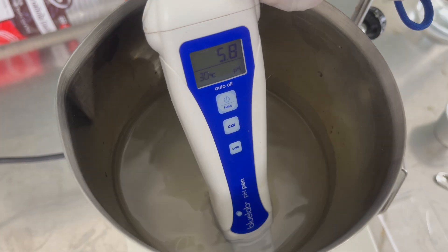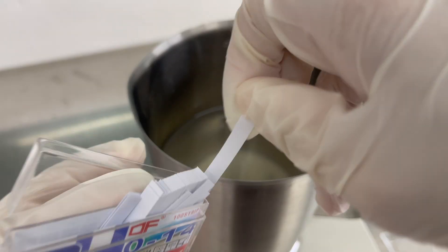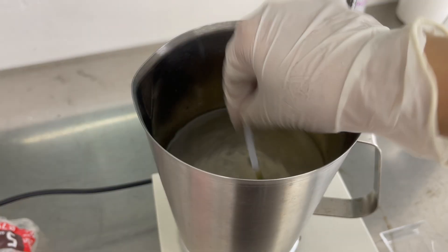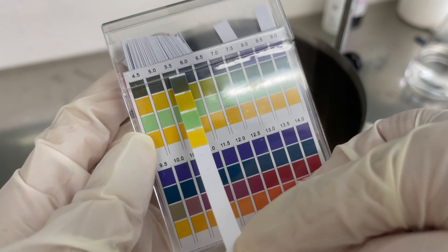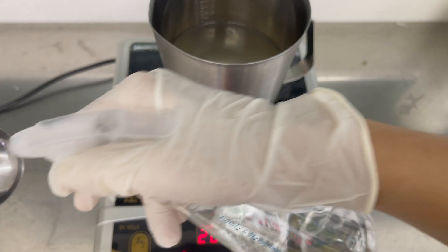Next, adjusting your pH. Measure the pH level using a pH meter or pH test strips. The ideal pH range is between 5.5 and 6.0. If needed, use your pH up or pH down solution to adjust it.